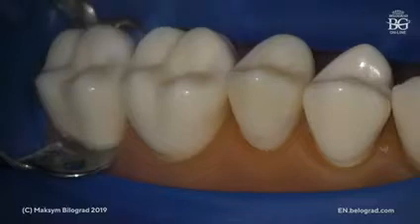For this, we use depth cutting burrs, and we always do a wax up, we always do a mock up, and then we prep teeth through the mock up. That helps us preserve as much tooth structure as we can, because some parts of the preparation will be done within the mock up, within plastic, and only some areas will be exposed in tooth structure. We are not preparing the tooth 0.5, for example. We prep just 0.3 within the mock up and 0.2 in tooth structure, but in total you'll have this 0.5.